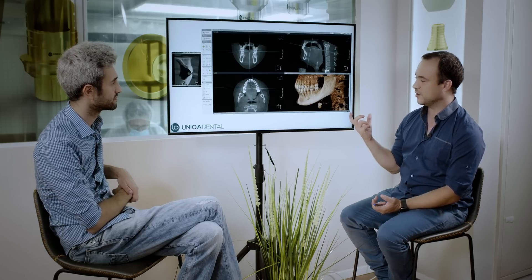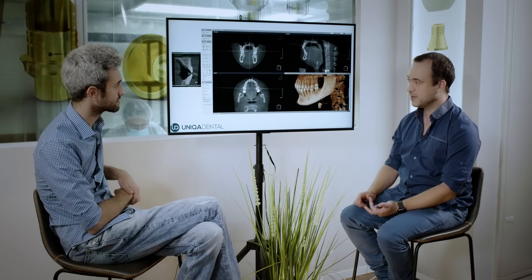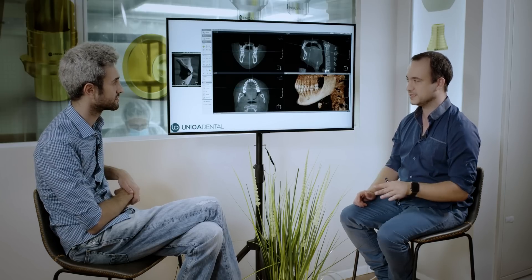But everything here is raw data. You can have it on a disc and you can have it sent by mail. But as a doctor I can't do anything with just this 3D reconstruction — I can't know all the dimensions, all the heights that I need to place the implants or to choose what implants I need to place. So first I take the 3D reconstruction of the bone and I cut it into three different slices.